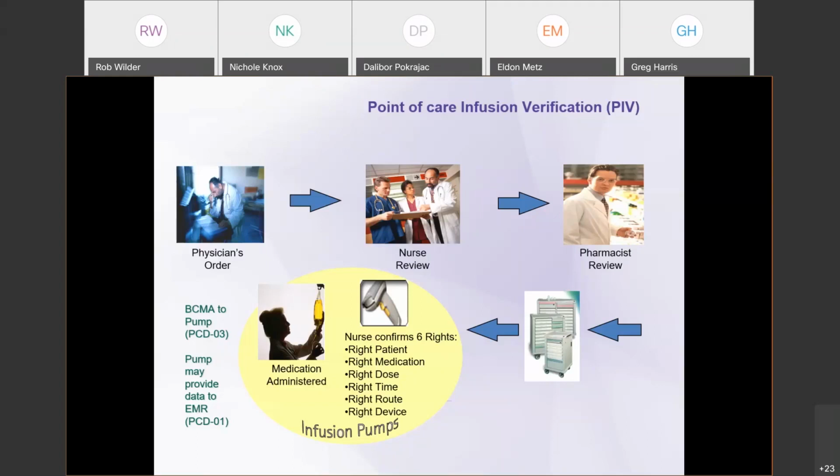Standard message types are included in this profile to support transmission of the content from barcoding systems, BCMAs, along with standard communication methods for sending content up to the patient's health record. The benefits include, of course, better safety in the infusion process when associating the patient, and more complete record of that device association for records keeping or root cause analysis directly tied to the patient's record.